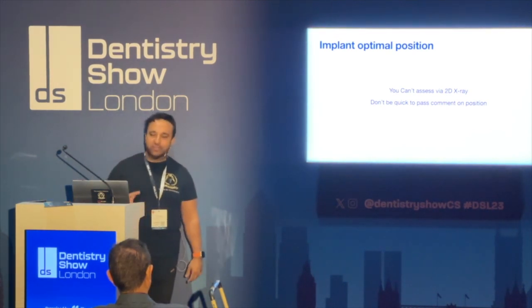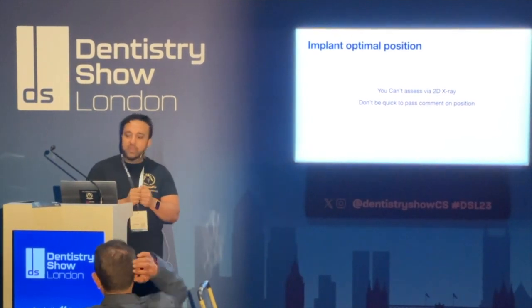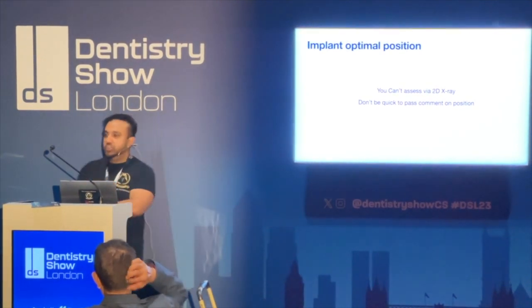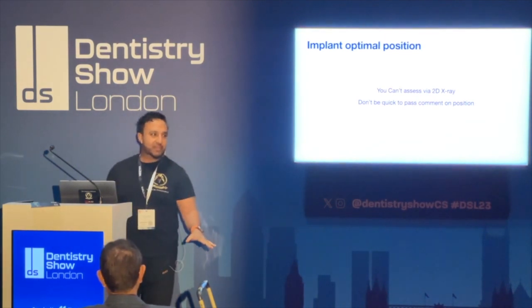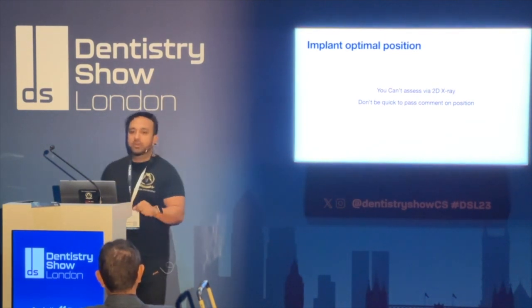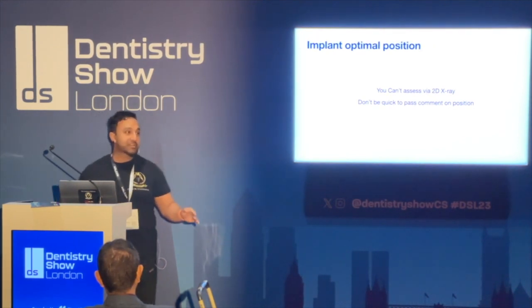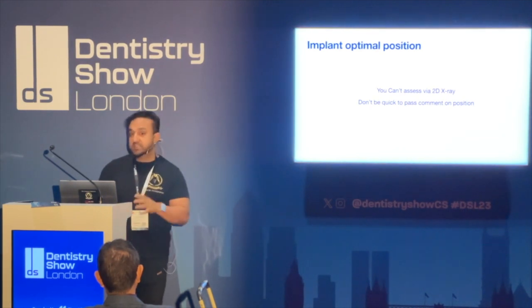So I don't get defensive. I go, okay, no problem. Who's the dentist? Let's get on the phone. And I have a conversation with them. And it's about understanding that you cannot assess the position of an implant from an X-ray. Okay? So do not be quick to pass comment on the position of an implant. And trust me, you're going to see some really rubbish work out there, and you're going to see some good work.